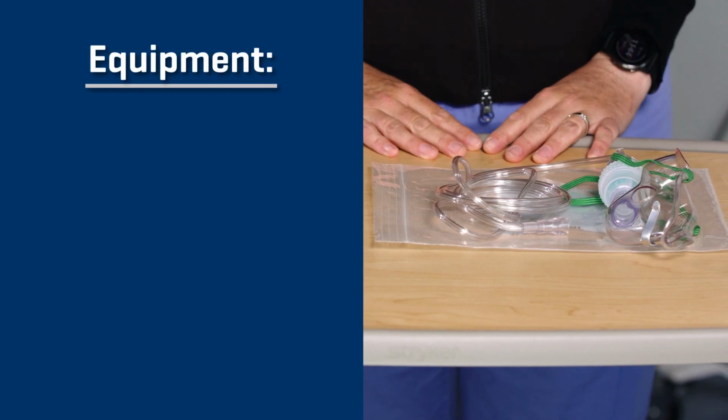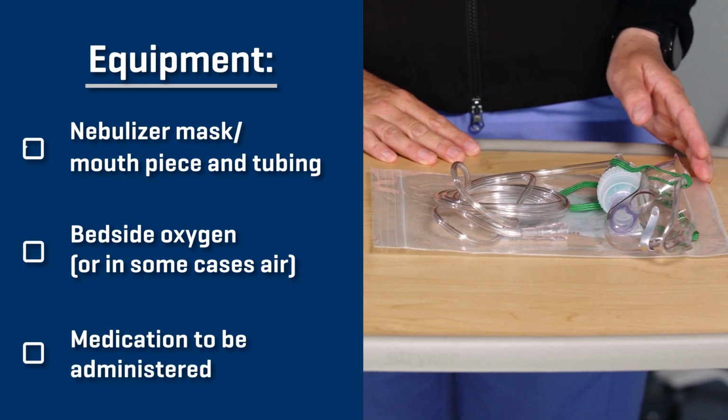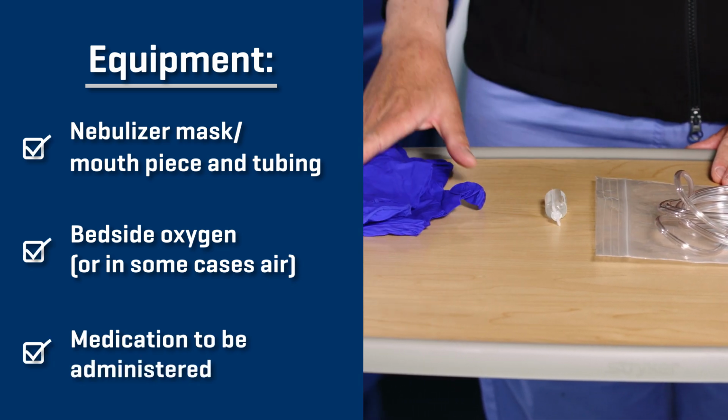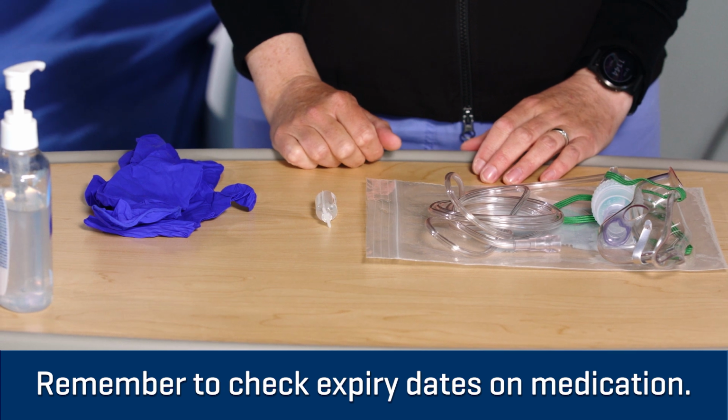This is a drug that I've given in the past, so I'm familiar with its mechanism and its side effects, but I have a medication card for reference as needed. I'm just now going to gather my equipment and wash my hands once more. The following equipment is needed to perform this skill: a nebulizer mask, oxygen tubing, the medication of choice, and gloves to wear while preparing the medication.